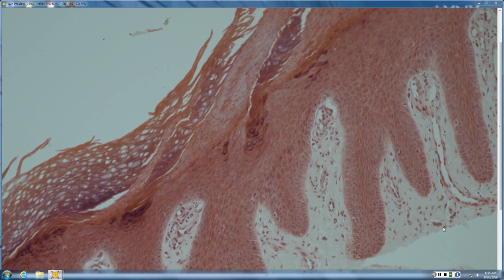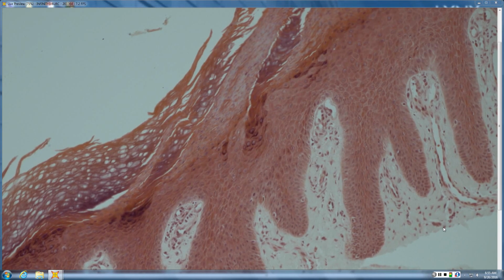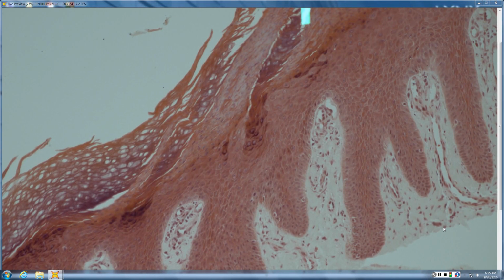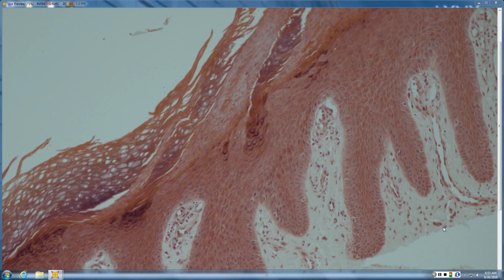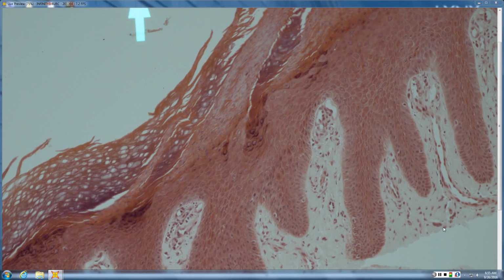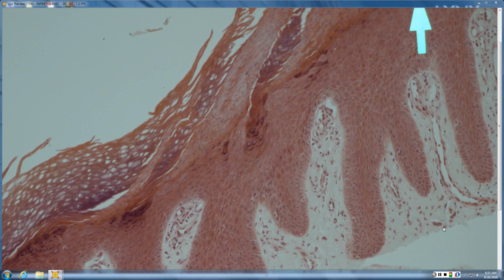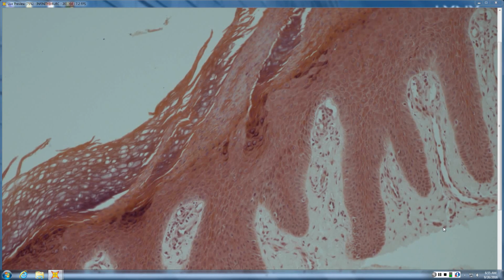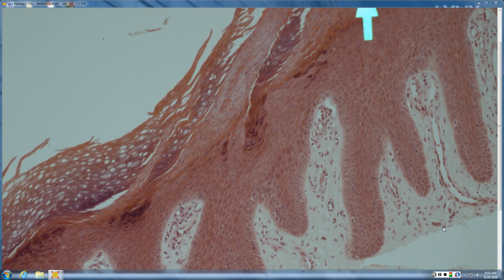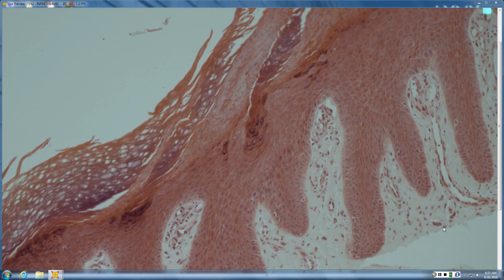And so that's normal. Whereas when you see parakeratosis, the reason why that occurs is because it's proliferating, like in psoriasis and other things, so rapidly that it doesn't have time to create the granules, and in fact the nuclei are retained, and so that's why you see parakeratosis. So it is normal for underneath para to see loss of the granule layer and underneath ortho to see retained granule layer. There are really two main exceptions to that. One is where you have parakeratosis but you still see granules underneath, that goes with granular parakeratosis, which we'll see here in a minute.